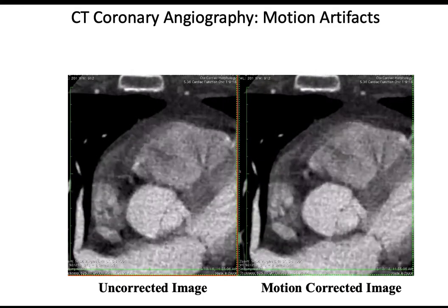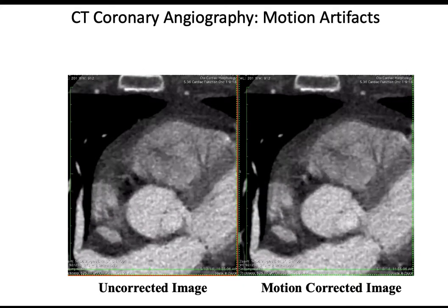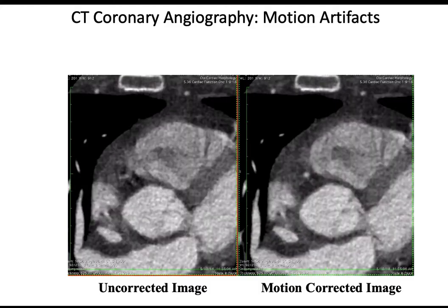And once you have an estimate of that, it's not any different, in theory, from the scanner's perspective, than the patient rotating at 4 Hz. Now what you're saying is not only is he rotating concentrically, but he's also drifting over things. And if you build that into the model, you can now make movies where that vessel is pretty clear all the way through, even in the periods of high motion.